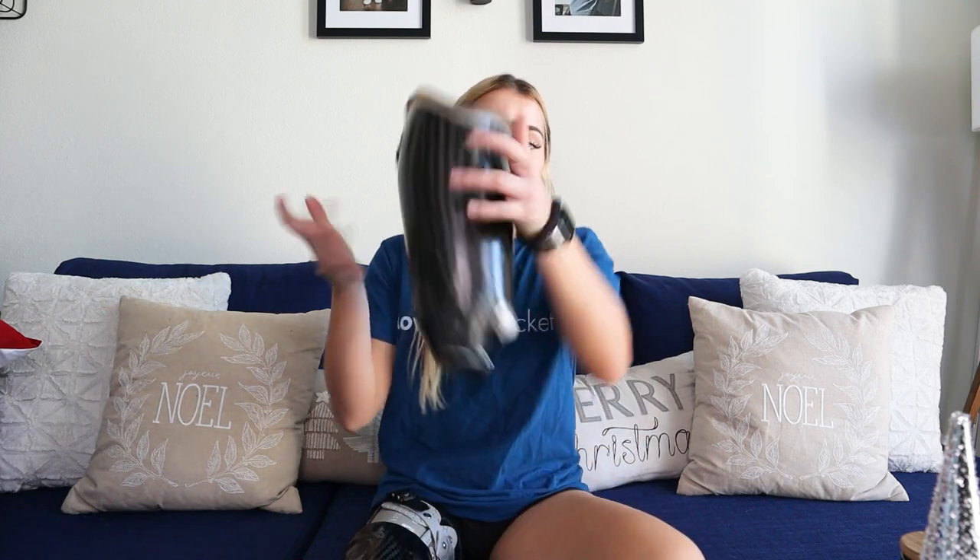For me as an amputee, I have a lot of problems with water weight fluctuation. In the morning, my stump will be kind of swollen and bigger. So that's really hard with something like this because you can't go anywhere but in, and it's really uncomfortable because I'm trying to squeeze my stump into it. My stump is not the same size it was when they casted me — and it's all because of water weight.